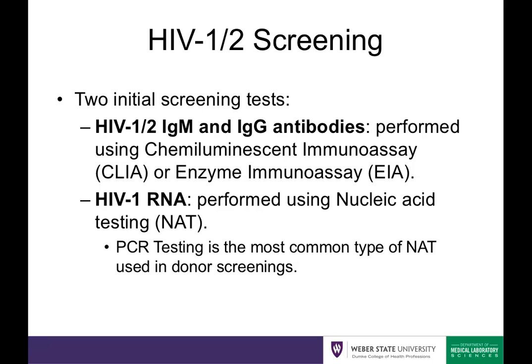So all 3 of those tests can be used in the same assay, which makes our blood donation testing just that much more efficient. If that test comes back negative, that's great. Obviously, there's nothing to worry about. If it comes back positive, they're able to do a differentiation to decide which virus is causing that reaction.